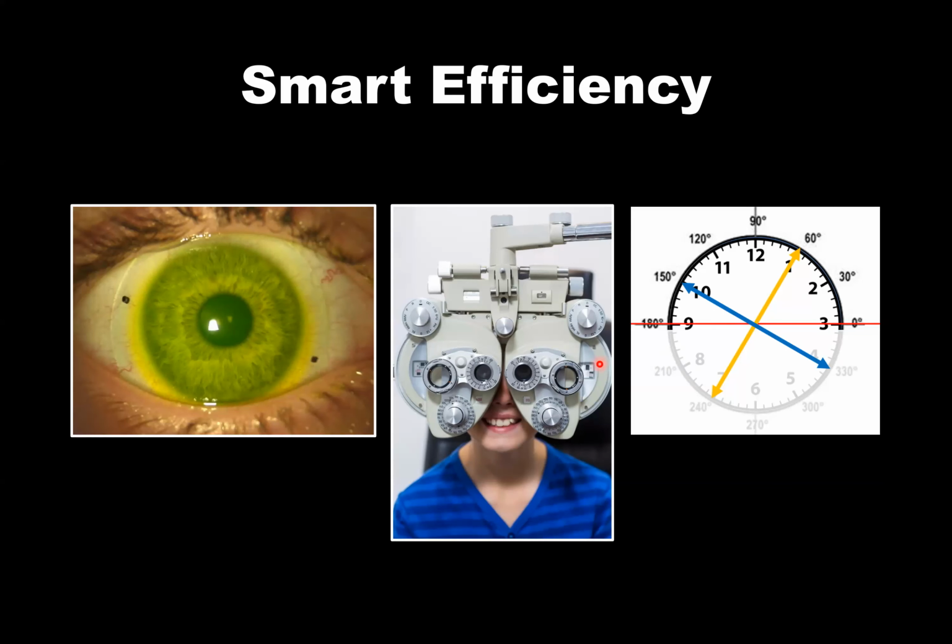So while the scleral lens may sit at this axis, the cylinder can be at a completely different axis. So you understand by placing your toric landing 15.5 or 16.5 on eye, if it's rotationally stable, you know for those 10 to 15% of patients that require front torics that you can add the residual cylinder to the front surface, knowing that it's going to stay on axis.